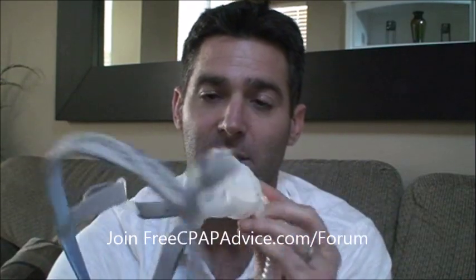This is their newest line of the AirFit — they have the P10, the N10, and the F10. This is the N10, the N being for nasal — it's a nasal mask. Let me show you some of the features on it, and then we'll get started with fitting.